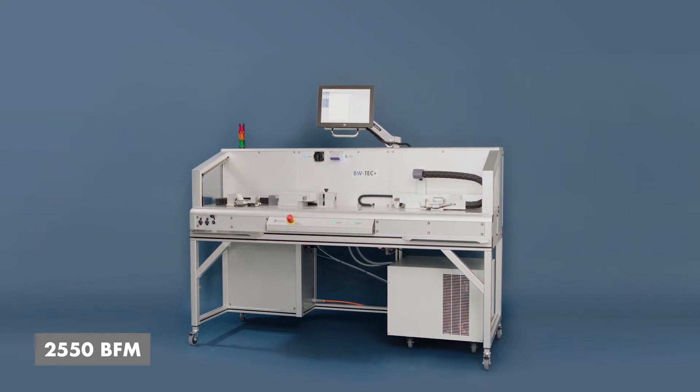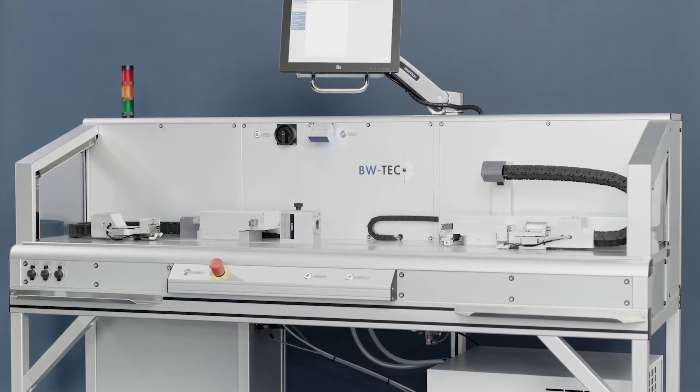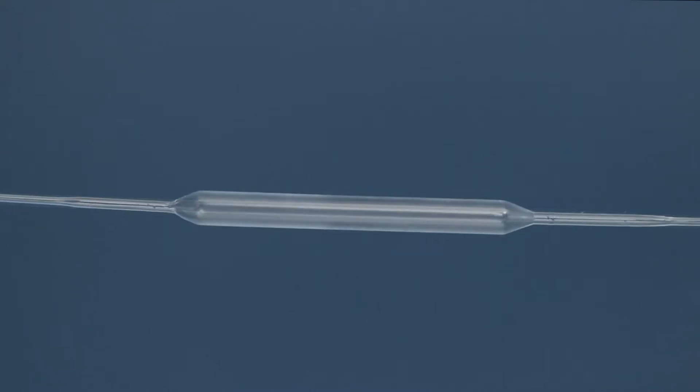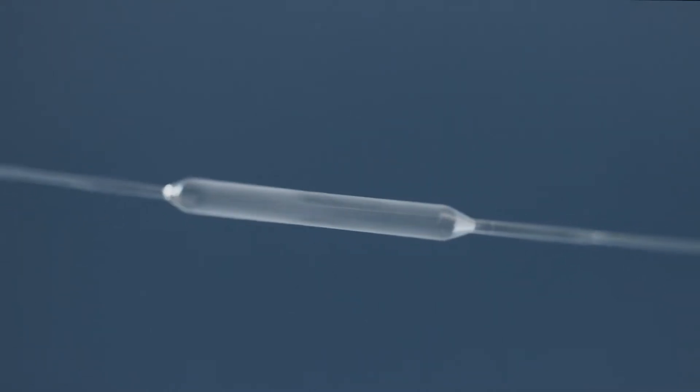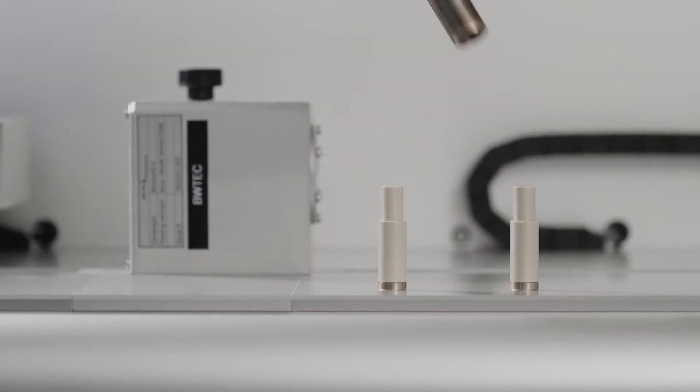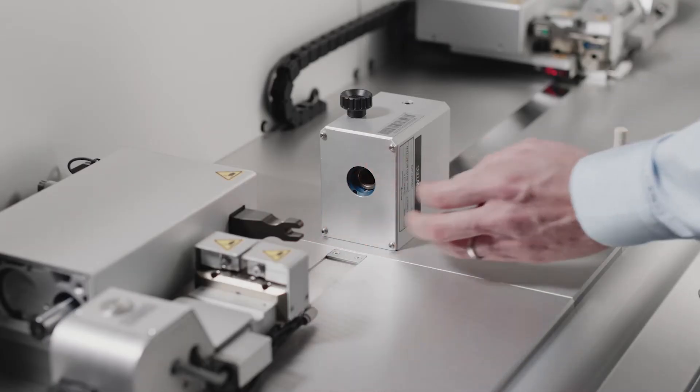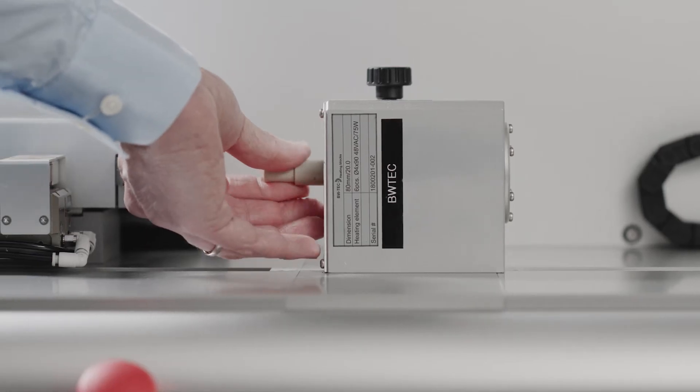The 2550 balloon forming machine is designed to produce a wide range of polymer balloons for angioplasty and other medical applications. The electrically heated stretch blow molding process enables the production of very accurate and repeatable high-quality balloons with tight tolerances in an extensive variety of sizes and shapes.